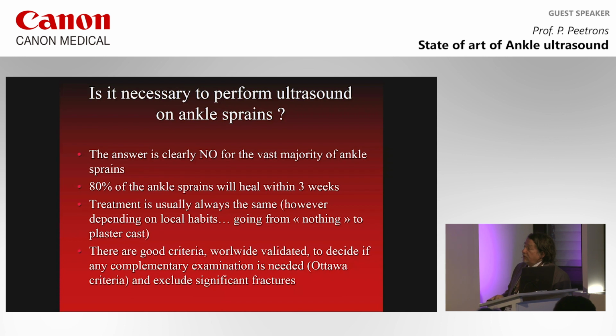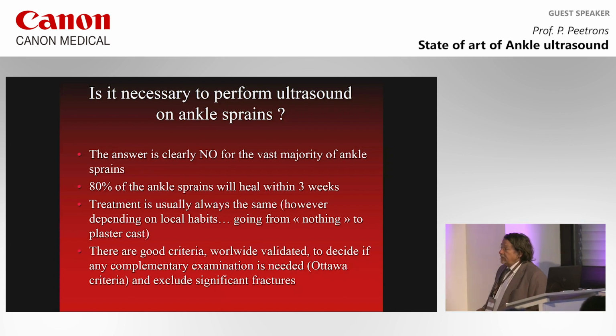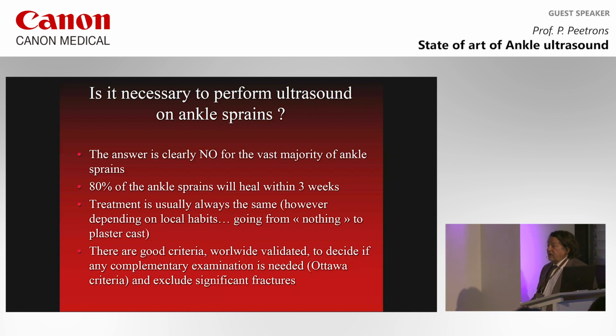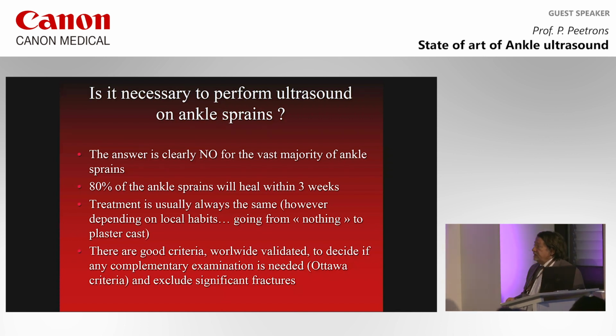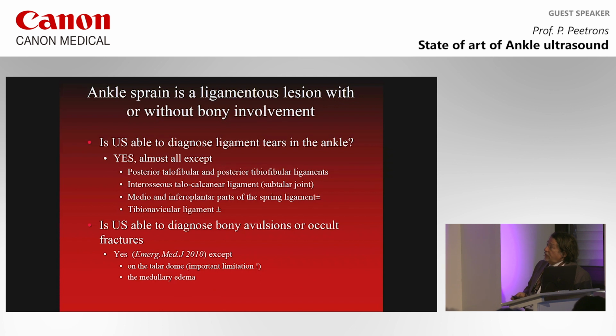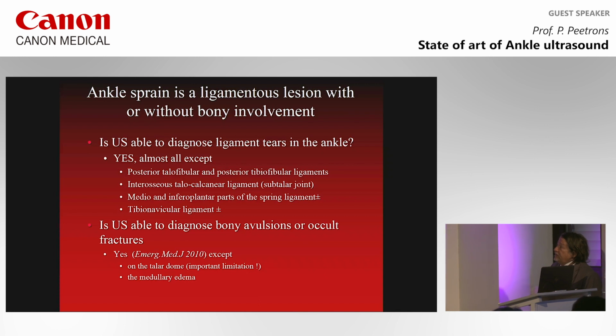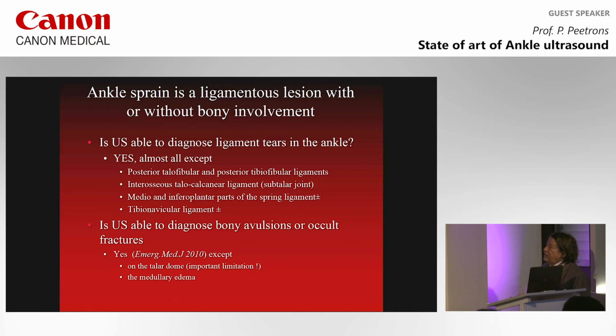There are very good criteria, worldwide validated, to decide if any complementary examination is needed. These criteria are called the Ottawa criteria, and you can find them in the literature everywhere. They come from emergency medicine in Ottawa, Canada, and they can exclude very easily significant fracture or significant lesions in the ligaments with avulsion of bone. So the ankle sprain is a ligamentous lesion with or without bony involvement. And ultrasound is able to diagnose ligament tears in the ankle, yes, almost all except the posterior talofibular and the posterior tibiofibular ligaments, which are not very important because they are always injured after other ligament tears.